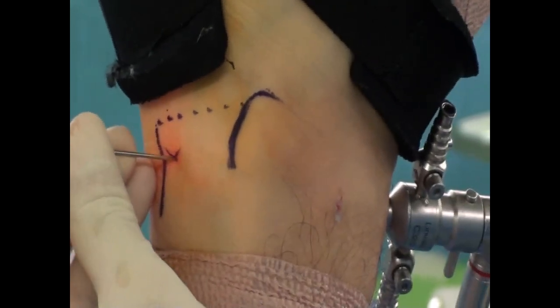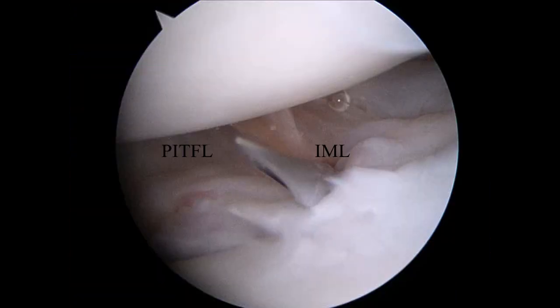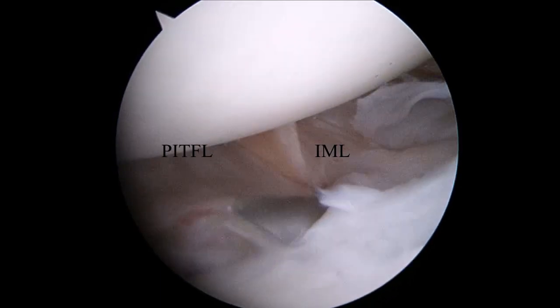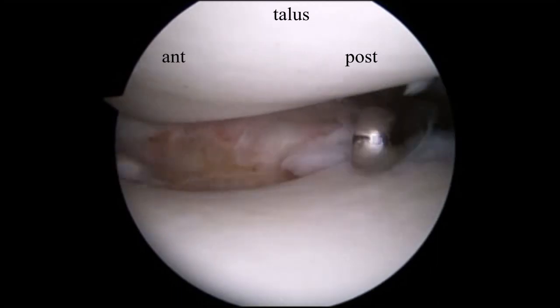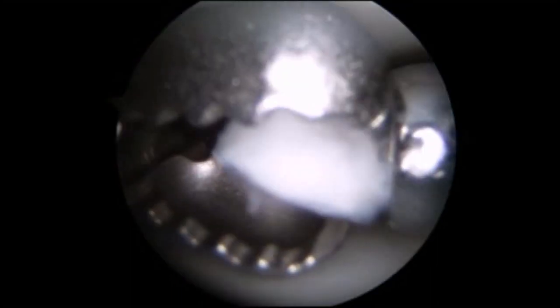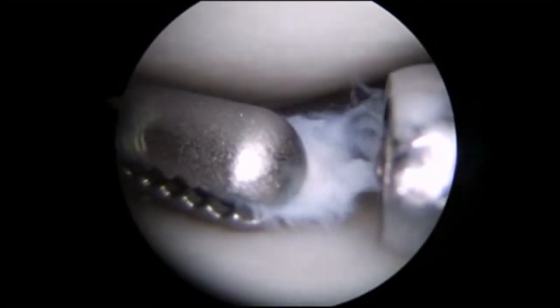The posterolateral portal is made one centimeter above the tip of the lateral malleolus, just lateral to the Achilles tendon, into the space between the PITFL and intermalleolar ligaments. Using three portals, you can easily hold and grab the loose cartilage and easily remove them.